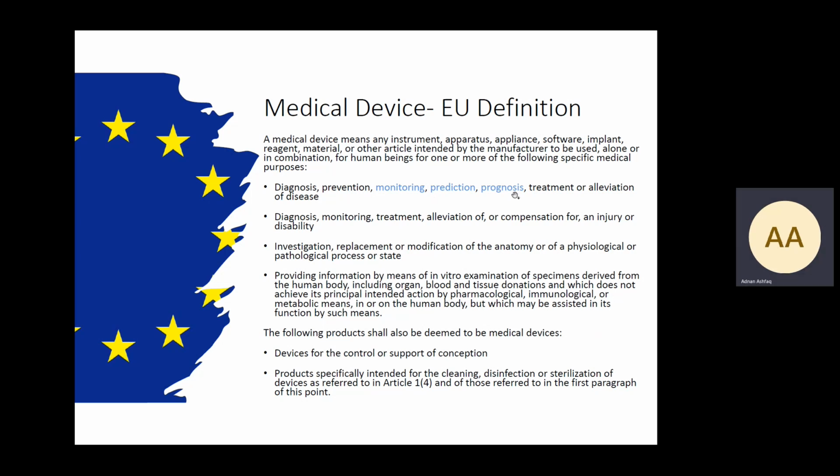And I've specifically called out these three because in software medical devices, these are three concepts which run commonly through the medical device's intended purpose. Either it's performing some kind of monitoring, prediction, or prognosis. It can be, of course, some of the other terms that have been used here, but these are specifically missed out on the next slide.